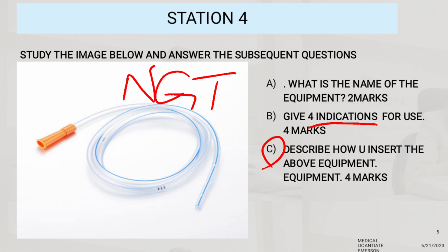So you get the NG tube itself, straighten it, and estimate the proper depth of insertion. Measure the distance to the ear lobe or angle of the mandible, then to the xiphoid process plus 6 inches. Then you have to note which black mark on the tube corresponds to this distance. On the NG tube, there are some black marks. So let me just mark them on the screen. There are 3 black marks there.